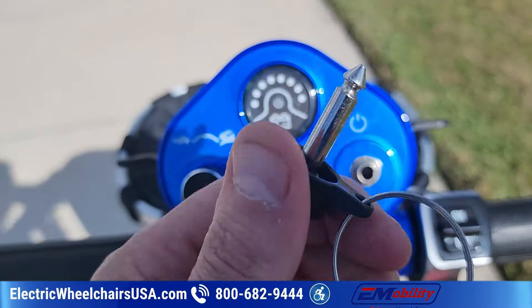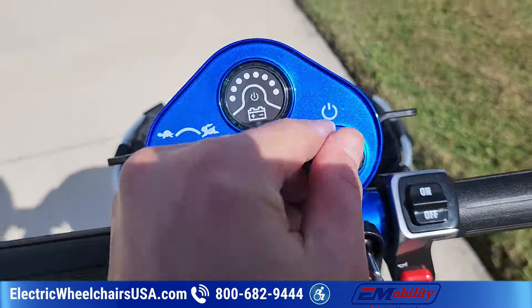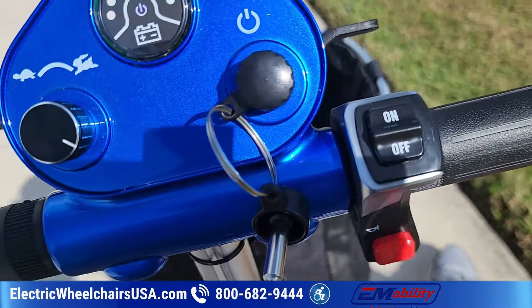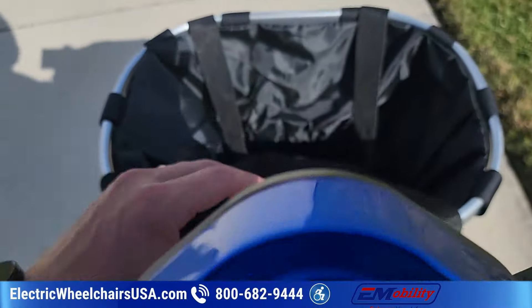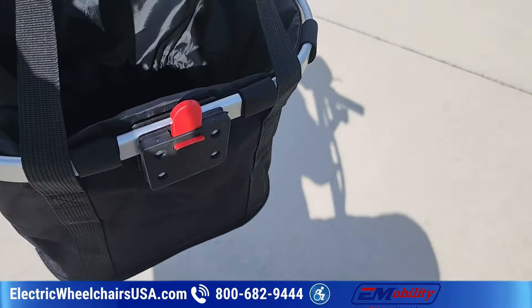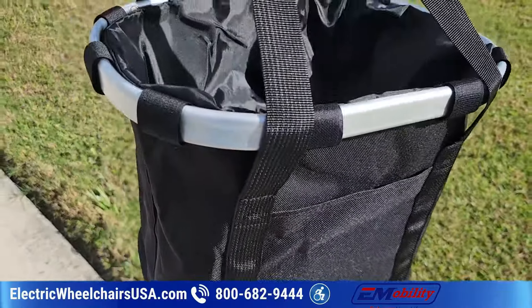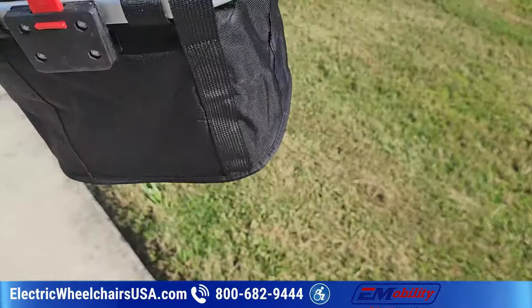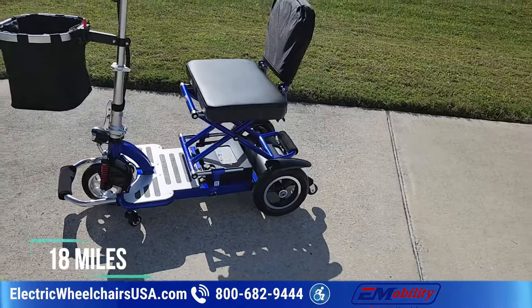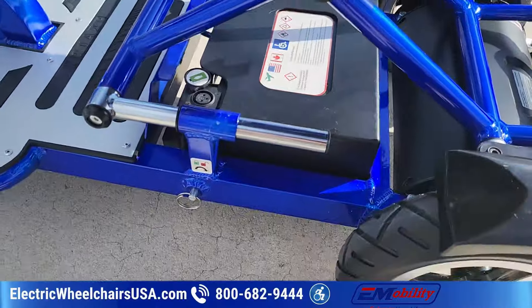It's a pretty simple key and you get a set of two. This is your horn. It also comes with this front basket, which is really nice — it's a nice oversized front basket with a handle, so if you're going shopping, like at a farmers market, you can take it off and carry it. Battery range on the scooter is 18 miles.